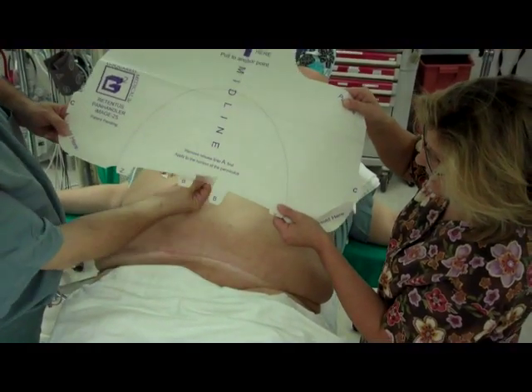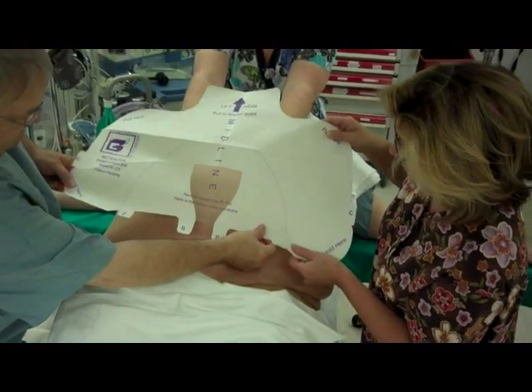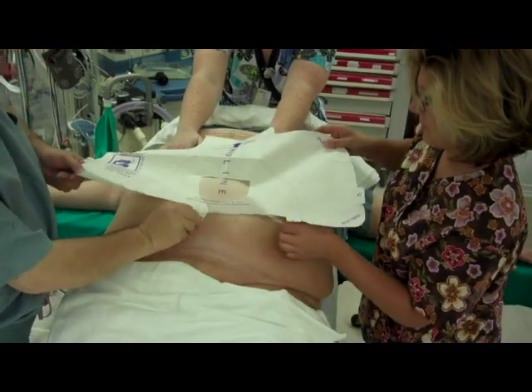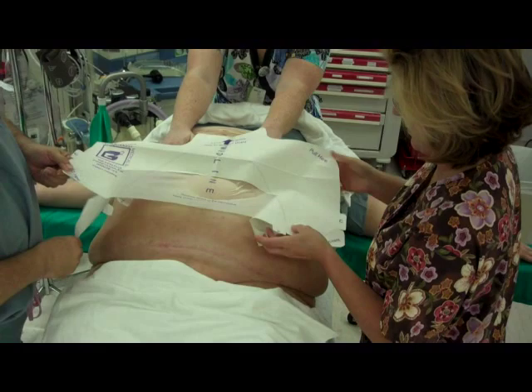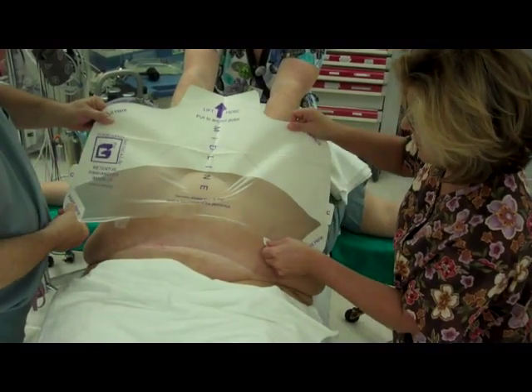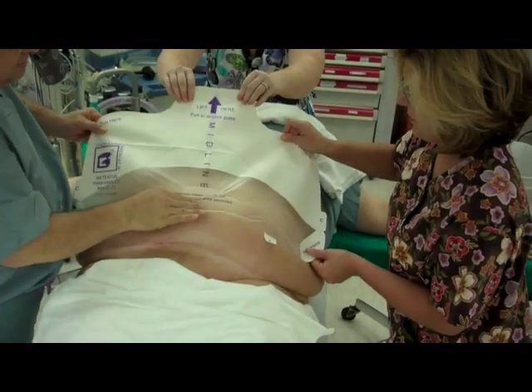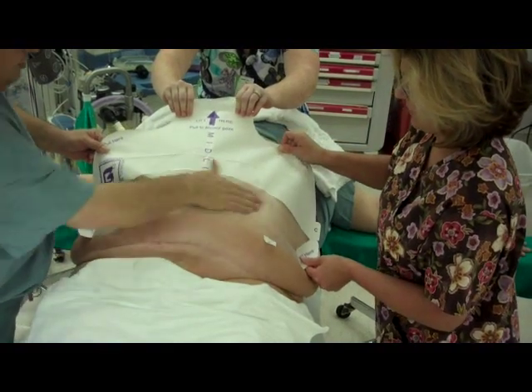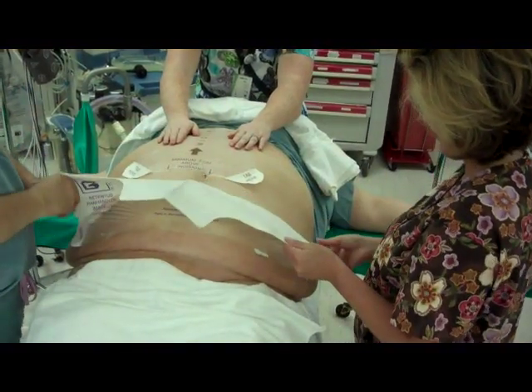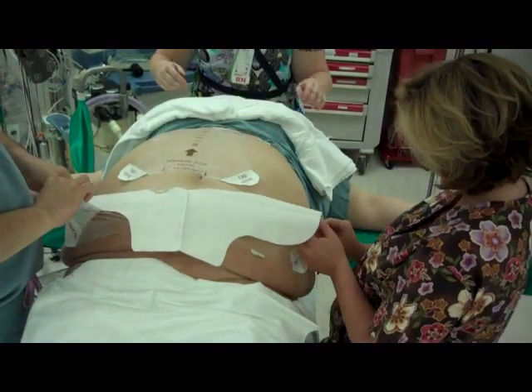Holding the retractor in tension, remove the A tab. Affix the edge of the retractor 5 cm above the incision. Now remove the B panels and apply to the patient, smoothing from midline to the hip. The person at the patient's head can release the pannus to fall back to its natural position. Retrograde the device. Holding the device in tension, remove the C panel.